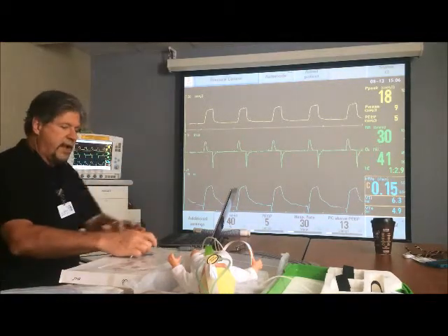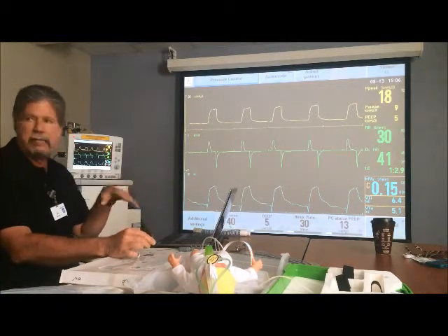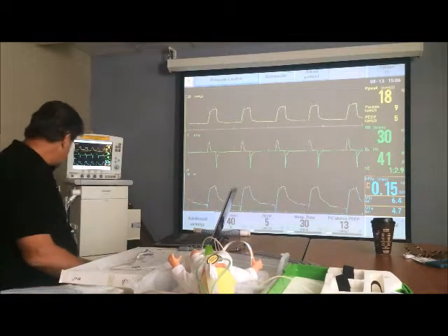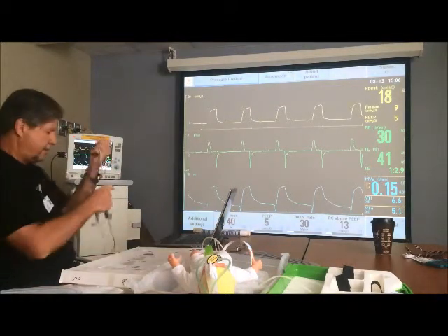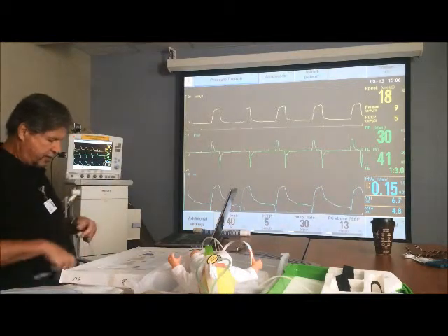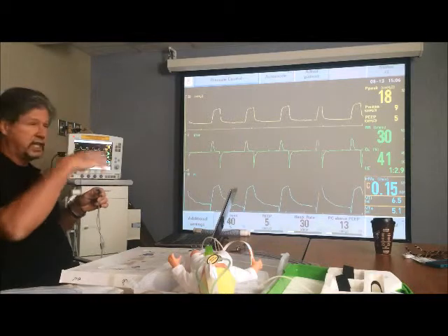The nurse, we don't have anything connected. The nurse puts a little air in the port, says, okay, I'm in, I can hear the burp. And then what we do is we connect the cable to the catheter. Okay, and we simply do that this way. And then we would start seeing the EDI occur.